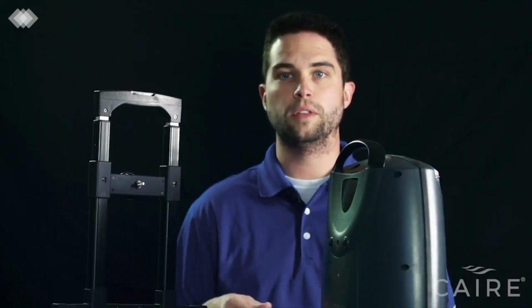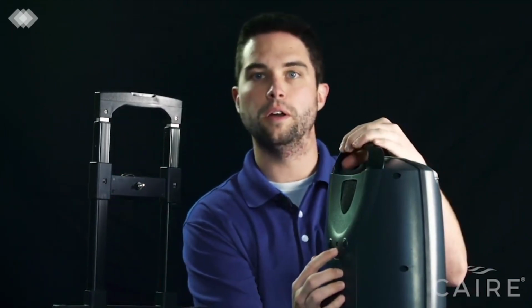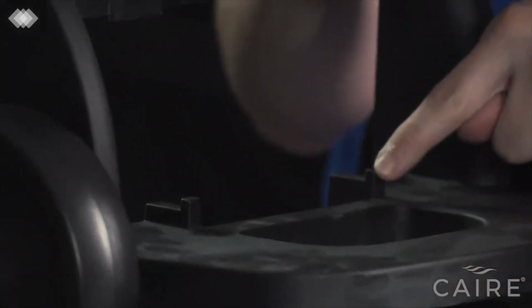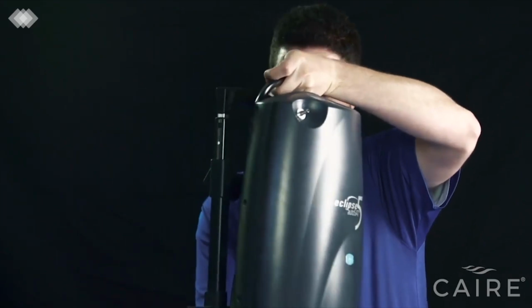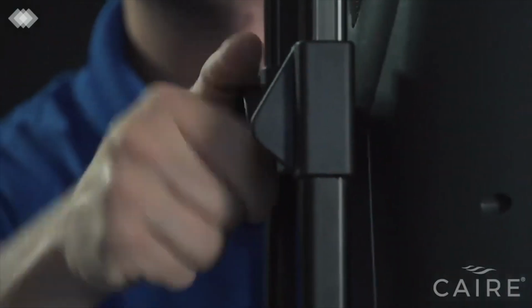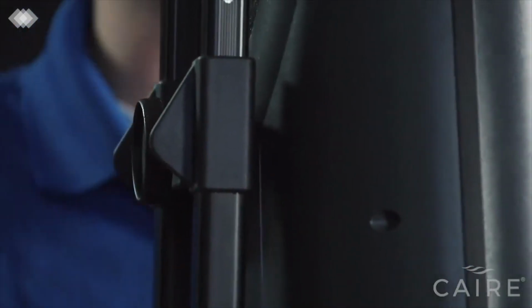Once you have the wheels on the cart, then you can install the cart onto the Sequal Eclipse. The screw with a turn knob on the back of the cart installs into this hole here on the back of the Eclipse. Note that there's 2 tabs on the bottom that kind of lock the Eclipse in place, so you want to line these up with the bottom of the Eclipse. Now let's install it on the cart. Once you have those pins connected and you feel it lock in place, begin turning this knob until it's secure. And now your Eclipse is ready to go.